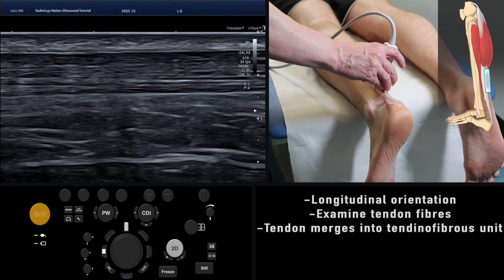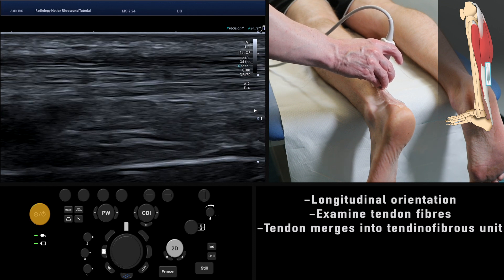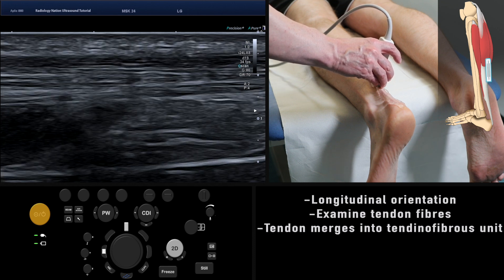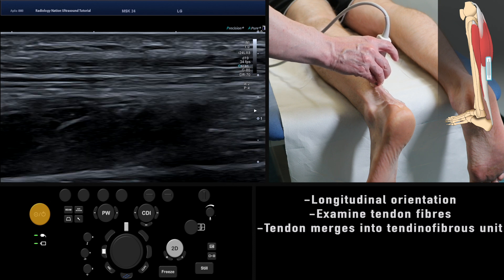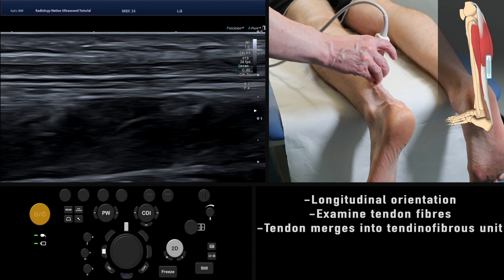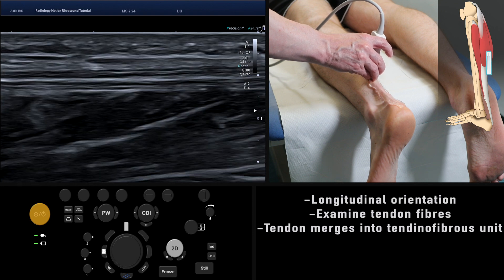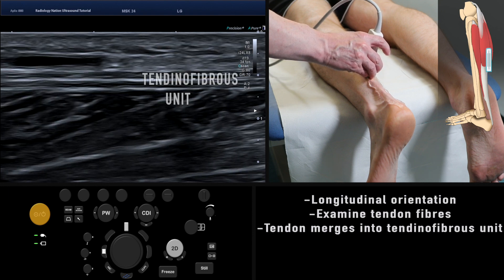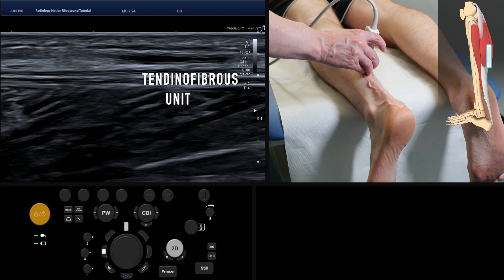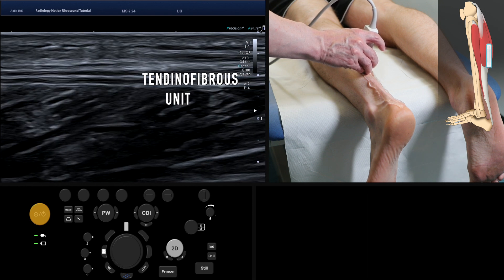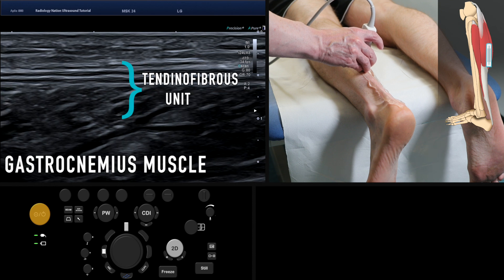Now assess the tendon fibres superiorly. A tear would appear as a fluid reflectivity disruption in the fibres. Gradually we start to see the tendon thin out as the fibres blend with the muscle belly of gastrocnemius. Here the tendon blends into a normal tendino-fibrous unit. A tear at this point would appear as an area of fluid reflectivity between the tendon fibres and the muscle fibres.